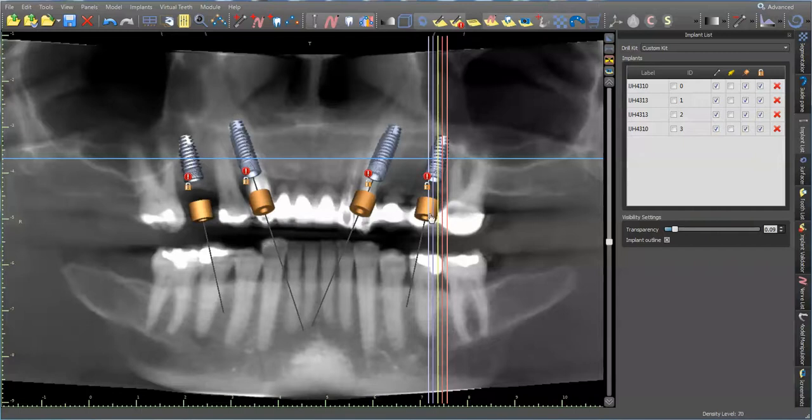So my plan is to section the bridge here, remove all these teeth. I could even section this one tooth off, take out this canine bridge here, and I could even use this tooth as well for support in the middle. So we'd have a support structure from 1, 2, 3, 4 teeth. So all I'm going to do is cut all this out along with the canine, and make an implant supported bridge across these natural teeth.